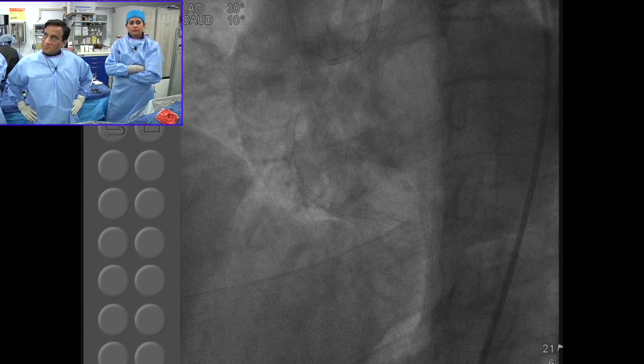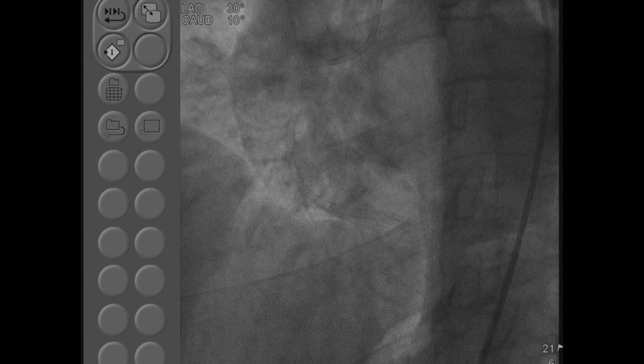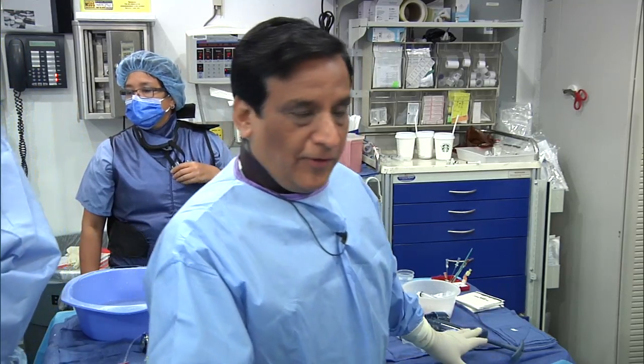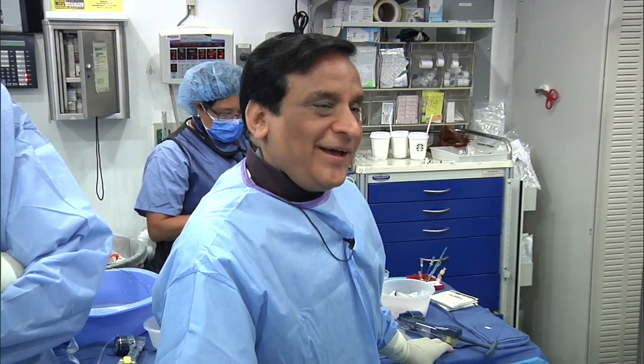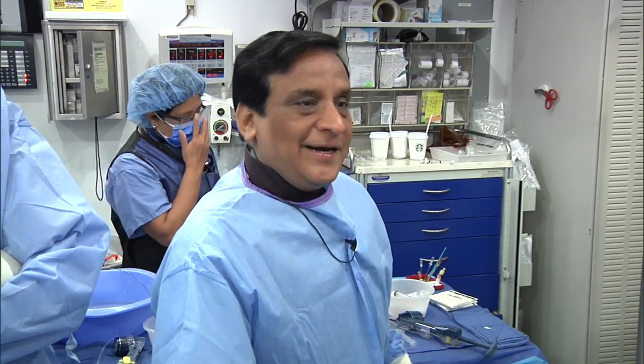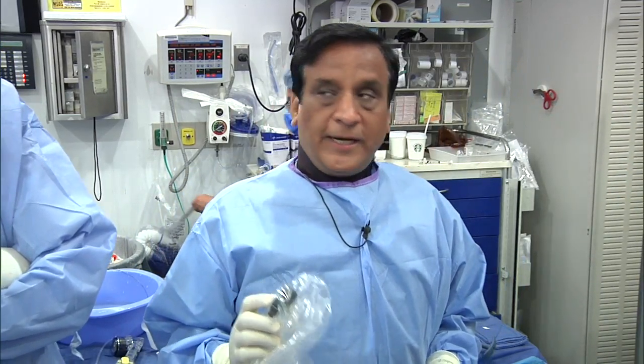Excellent point, Anu. Valuable tips, beautiful case, solid technique. Sameen, just as another closing point, a lot of encouraging trials show the benefits of closure devices. You're closing most of your groins? Right, we have been doing it for a long time. We actually have more complications with manual compression than closure. So I have a very, very low threshold for using a closure device, even if there is some disease. Knowing that we have a lot of devices, AngioSeal, Perclose, and Minx, in 95-96% of cases, if not higher, closure is used in the Mount Sinai cath lab.